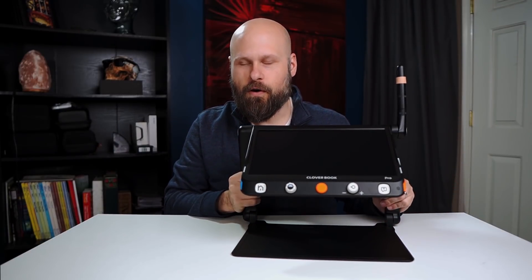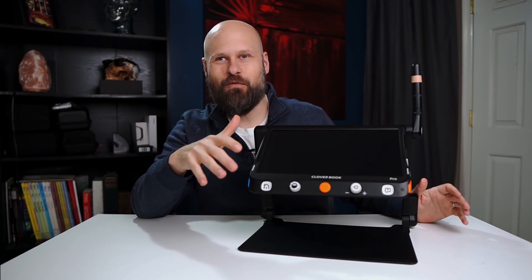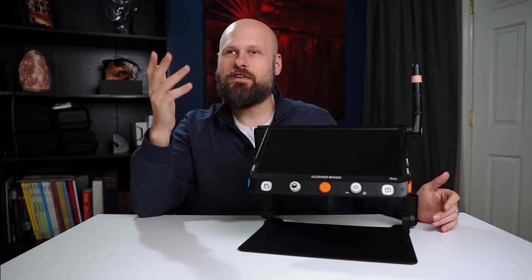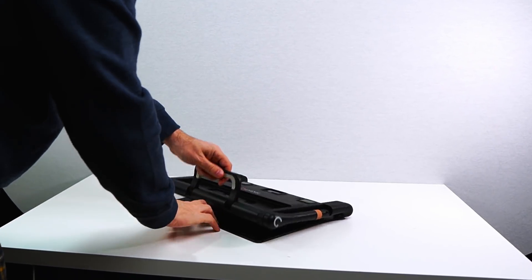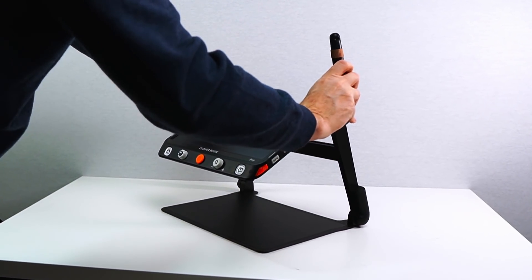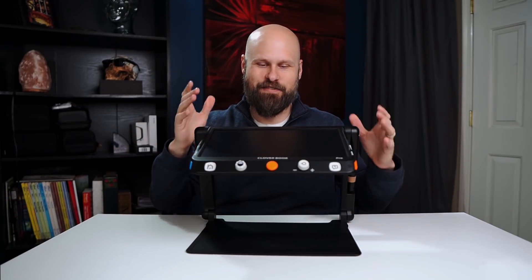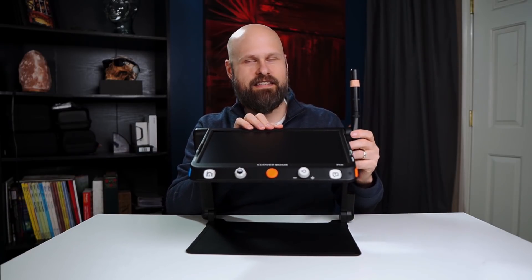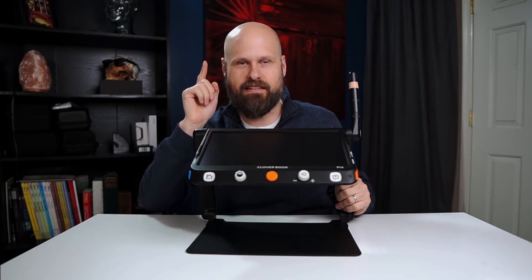Let's talk a little bit about the hardware for the CloverBook Pro. This is the Pro version — it has all the bells and whistles, top of the line. There are actually two other versions you can choose from. The first thing you'll notice is that the CloverBook takes the same design language we've seen with other portable magnifiers, but it's doing some things better — actually a lot of things better. They have the integrated distance camera built into the device. It's not an extra attachment you have to pull out and plug in; it's already on here, ready to go anytime you need it. That's fantastic.